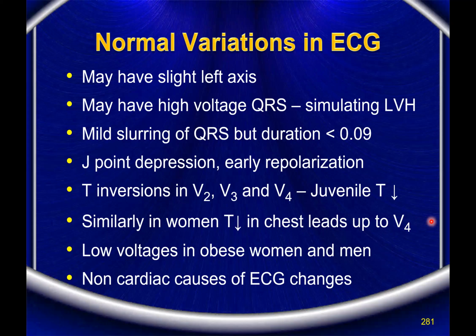Now here, one more thing. If the patient is obese and you make him lie down flat for recording the ECG, the abdominal obesity pushes the diaphragm up, and that will shift the heart sort of horizontal. Heart, instead of being vertical in the chest, is more spread out horizontally. That results in changes in L3 and aVF. So what you have to do is record what is called deep inspiration L3 aVF.